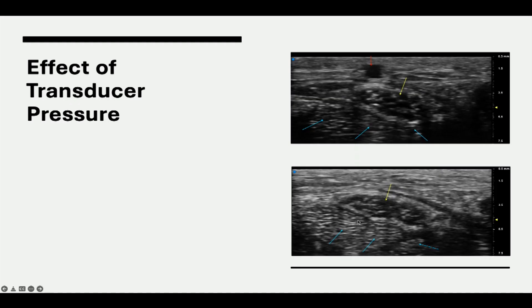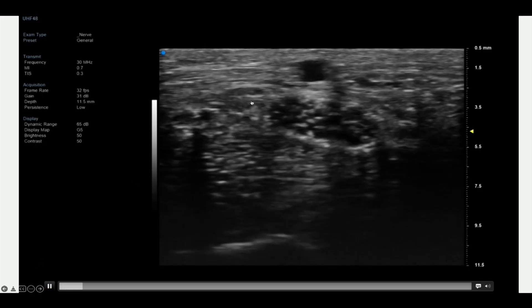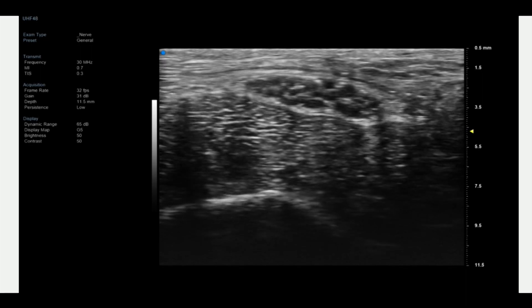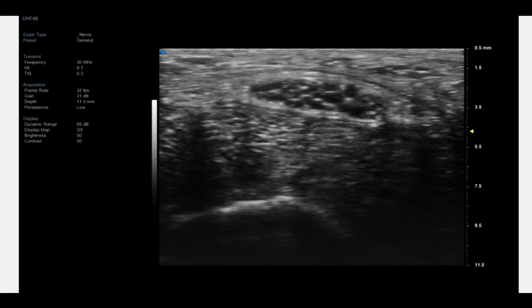Sometimes applying transducer pressure intentionally can provide better conspicuity by getting the nerve closer to the surface and helping distinguish some of the features. So as long as we're aware of the amount of transducer pressure we're using, we can use that as an effective tool. Here's an example of it moving — we can see the change from little pressure to more pressure, and that changes the effect of our image.